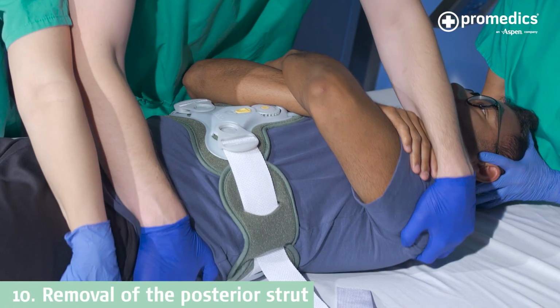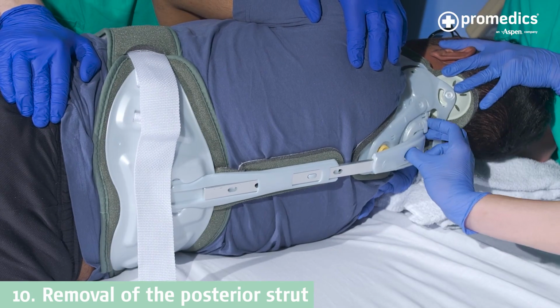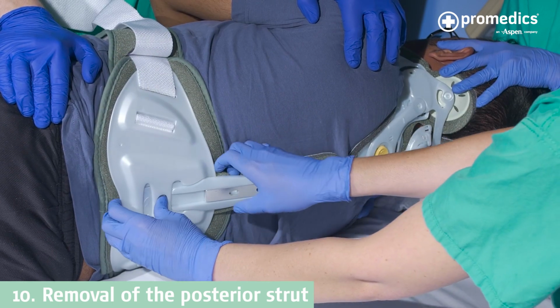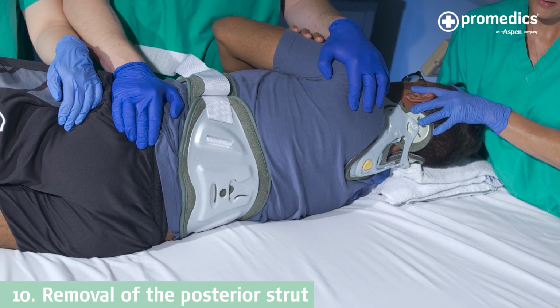Perform a 4-person log roll and ensure the patient is secure. Push in the button at the top of the strut and push up until it's released. Repeat this at the bottom and pull out the strut from the lumbar panel. Log roll the patient back.